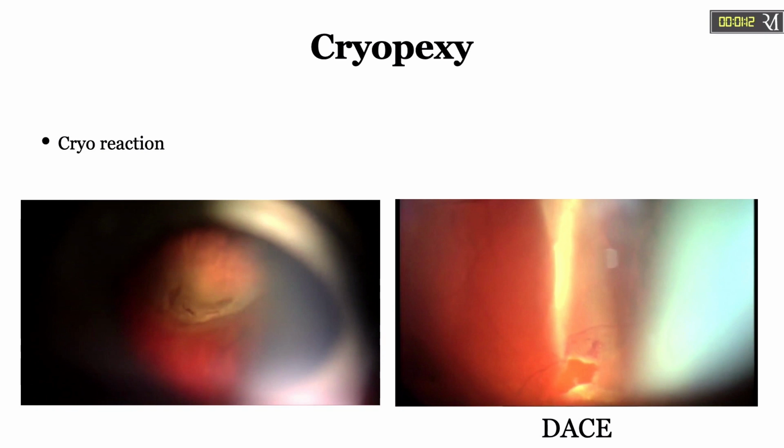Don't stretch the lids, which will stretch the sclera as well. If you make the aperture of the eye less stretched, this may give you a sufficient indentation, which will let you reach the retina without doing excessive indentation.